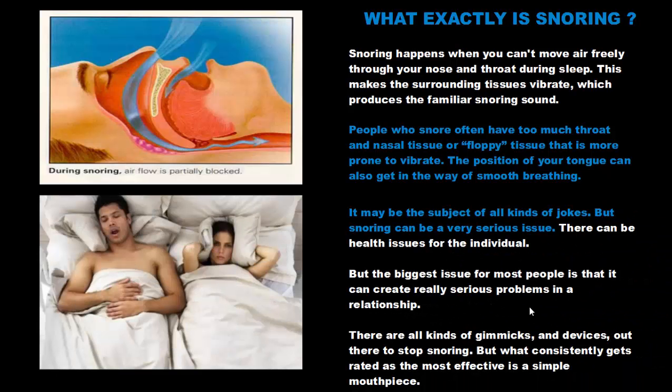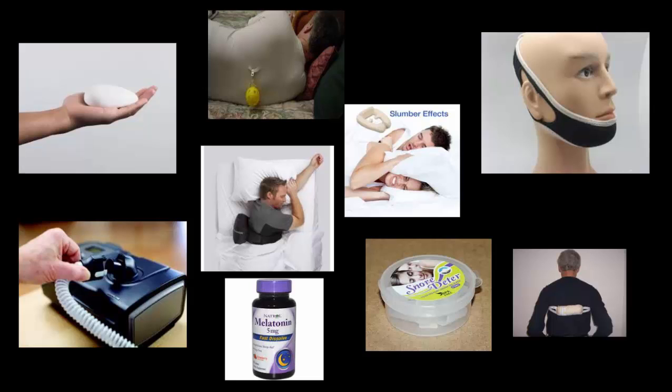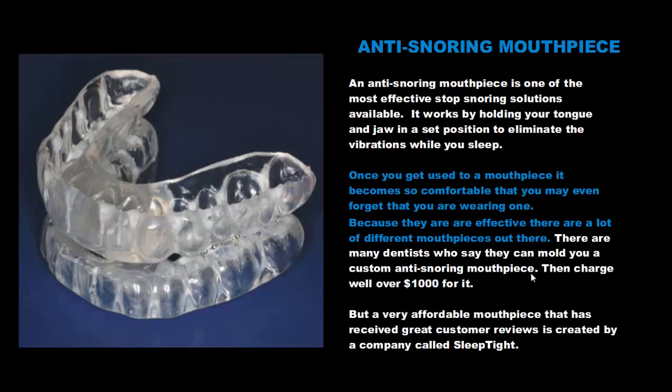Now, it is constantly the subject of jokes, but there can be health issues for the individual. But the biggest issue by far for most people is that it can create really serious problems in a relationship. Now, there are all kinds of snoring devices out there, all kinds of gimmicks, but what consistently gets rated as the best tool to stop snoring is an anti-snoring mouthpiece. It works by holding your tongue and jaw in a set position to eliminate that vibration while you're sleeping.